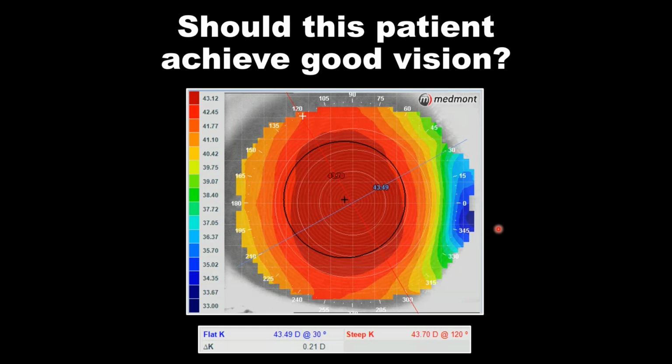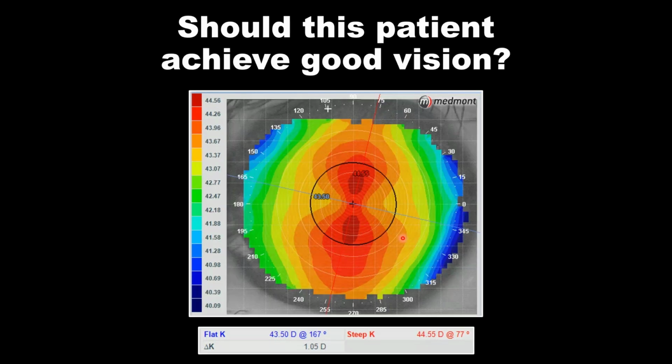So related to any kind of medium for correcting a patient's vision, of course, looking at this topography tells us that this eye should correct to a high level of visual acuity, because we really have very little, let's call it, action within the pupil. The eye has a very uniform and arguably ideal shape to bend light.